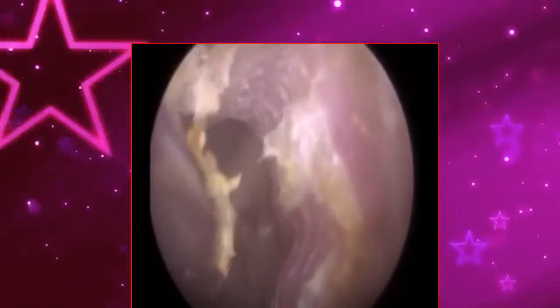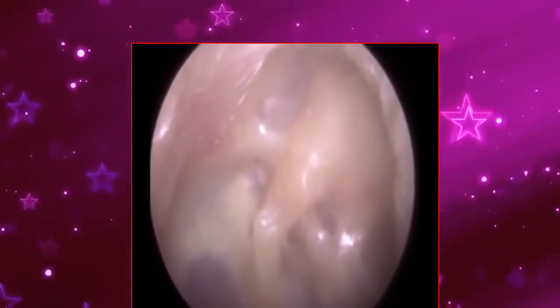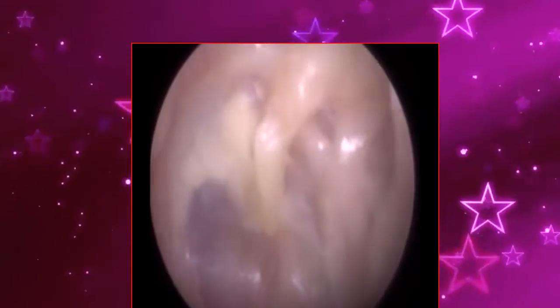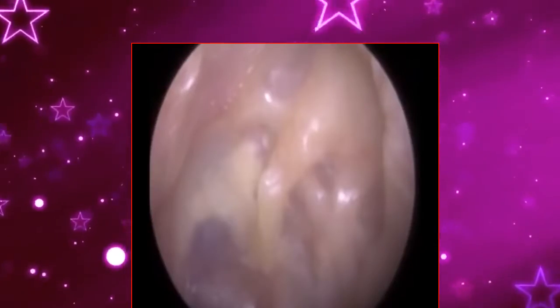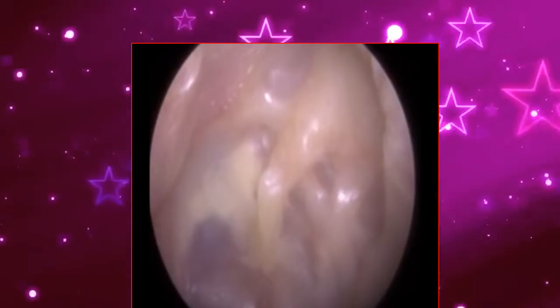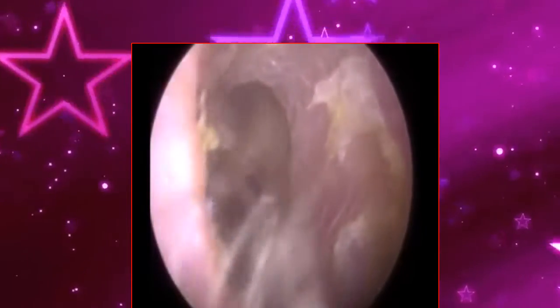Retrospectively, I wish I took the image using my Otocam, which is a video otoscope, but it's great for still images. But what I've actually used here is my iClearScope. The iClearScope is fantastic for videos, but it doesn't really give great still images. Decent enough, but so that image there, in a moment, you will get, for those students or anyone else that's interested, here's a quick still image, but later on at the end of the video, I have annotated it, I've labelled it.